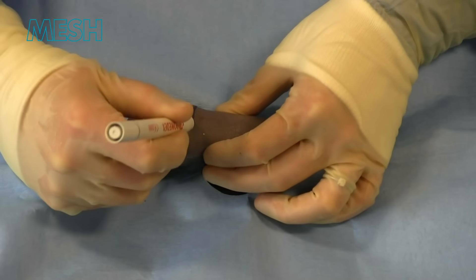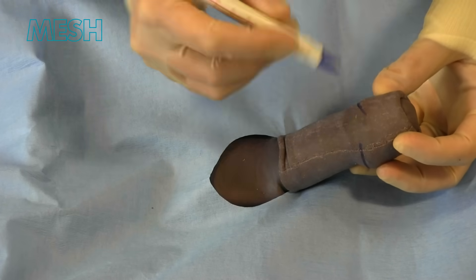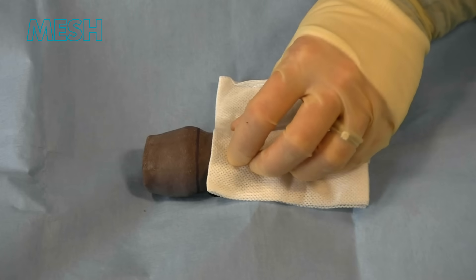We mark around the glans ensuring that there's plenty of length for the erect penis and there's not going to be any pain or discomfort regarding how much skin we remove. We make a slight V at the frenulum underneath the penis.